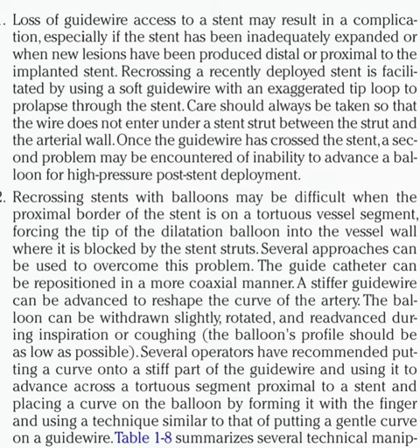Care should always be taken so that the wire does not enter under a stent strut, between the strut and the arterial wall. Once the guidewire has crossed the stent, a second problem may be encountered of inability to advance a balloon for high-pressure post-stent deployment.